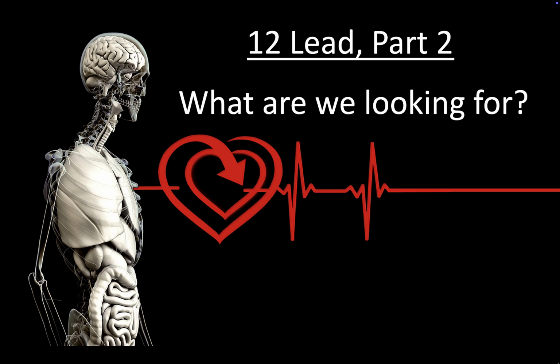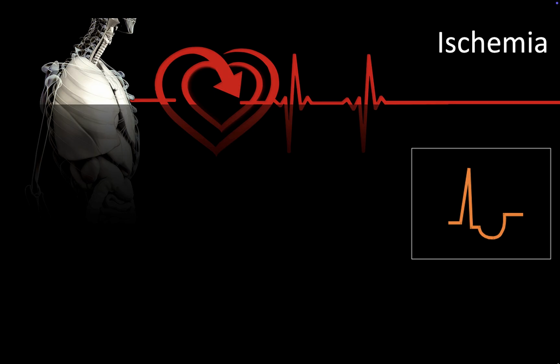Hello, welcome to 12 lead part 2, where we're going to talk about what we are looking for on our 12 lead. Let's start with talking about the parameters and the different things that show up and why.